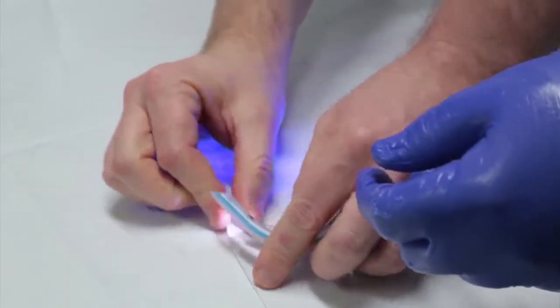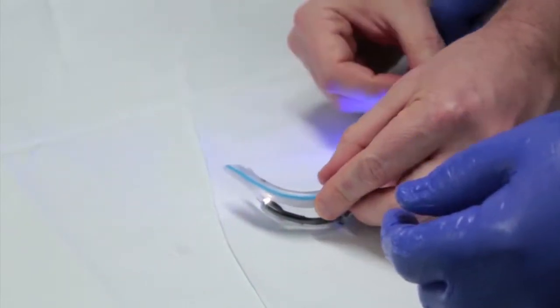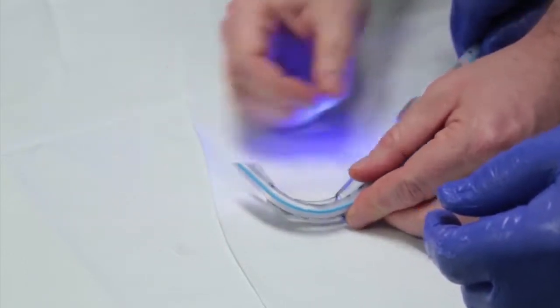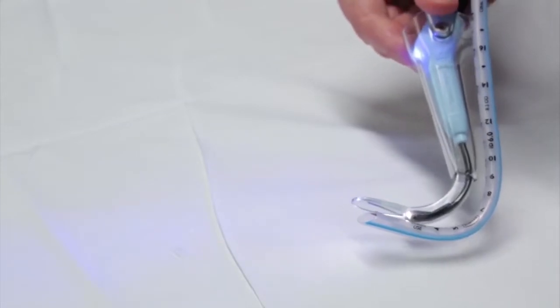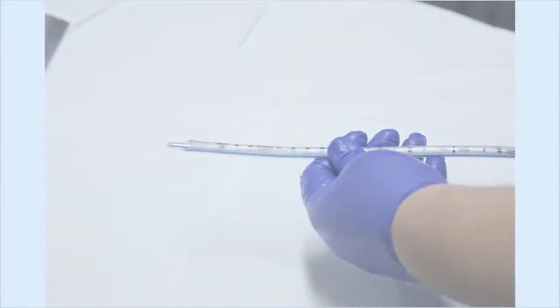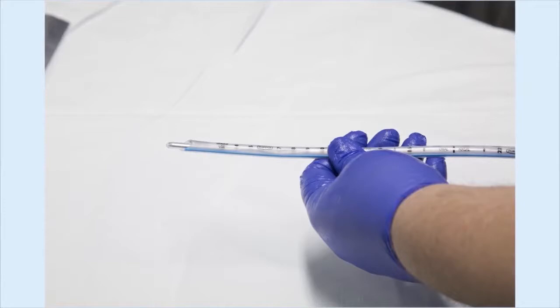One tip to ensure successful intubation once the vocal cords are visualized is to mold the shape of the endotracheal tube to the hockey stick shape of the video laryngoscope. To avoid injury to the airway, ensure any stiffening stylet does not protrude beyond the end of the endotracheal tube.